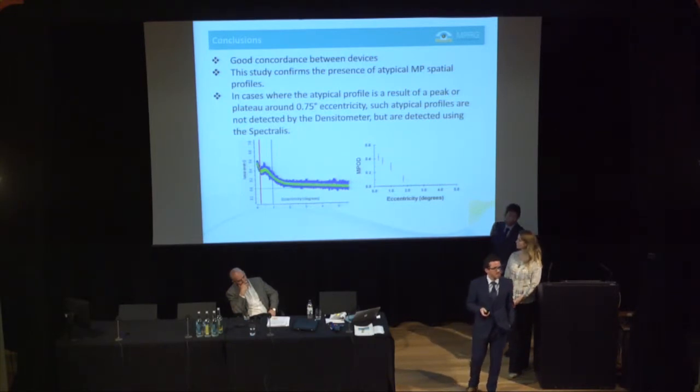Right, so I'm putting on my clinical hat now. The obvious thing has to do with the concept of prescriptive carotenoids. If we're able to measure precisely, then for patients with an atypical profile, we would want to supplement them with either zeaxanthin or meso-zeaxanthin, depending on what you think is going to work better. But you would want to use a high-dose zeaxanthin isomer, right?